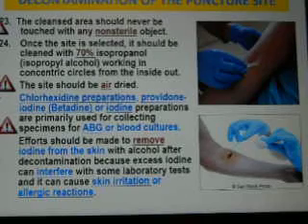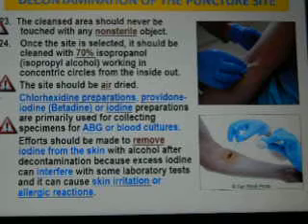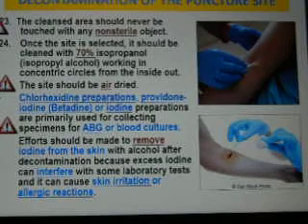And remember, guys, once you tie your tourniquet, you've ID'd yourself to your patient, told them where you're from and what you're there for. You have ID'd them properly with your requisition form. They're in the seat, they're comfortable, they're safe. You've communicated with them on what site they like best. You've tied your tourniquet on your patient. You use your index finger on your non-dominant hand to locate your vein by feel and not sight. Once you've found your vein, you're going to pop your tourniquet.